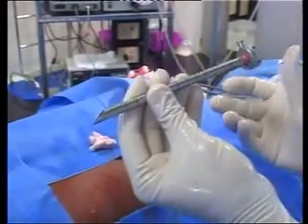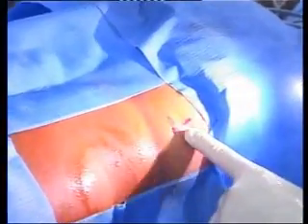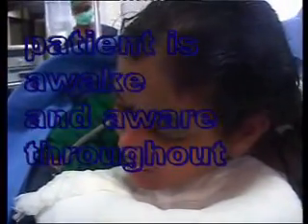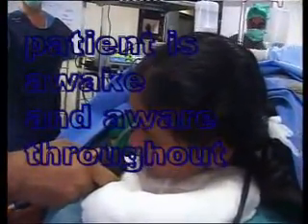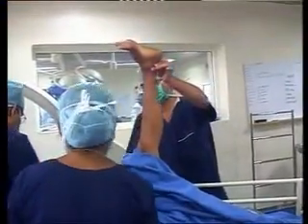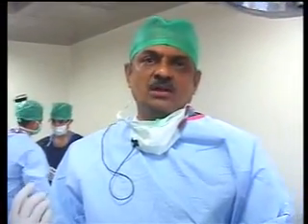The removed fragments are displayed along with the 8mm skin incision cannula used in the procedure. An HD camera was used for visualization with the scope used for this surgery. The patient was monitored throughout for vital signs and was awake and aware. She reports full relief of pain with no pain whatsoever, only some discomfort in the back. Straight leg raising improved from 20 degrees pre-operatively to 90 degrees at end of surgery, and the patient is able to move her toes well. This procedure is a targeted fragmentectomy.